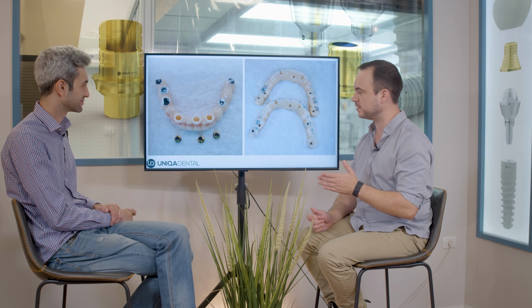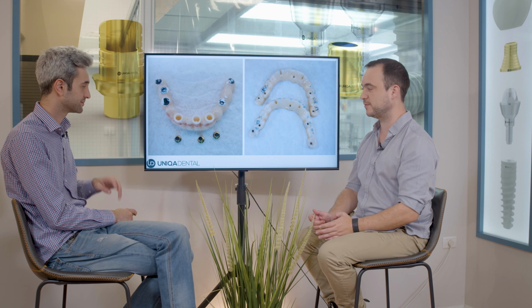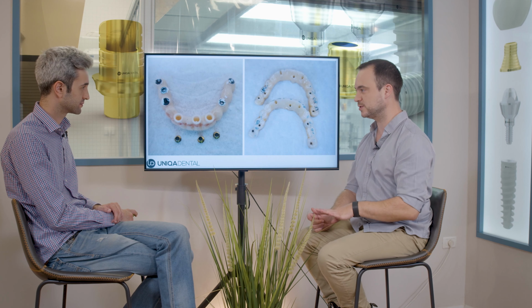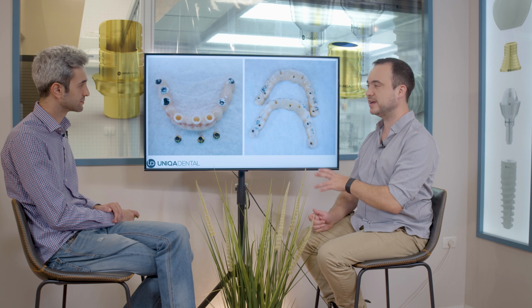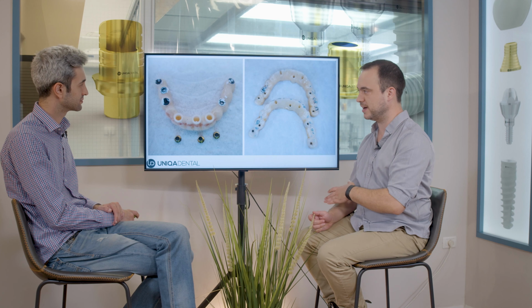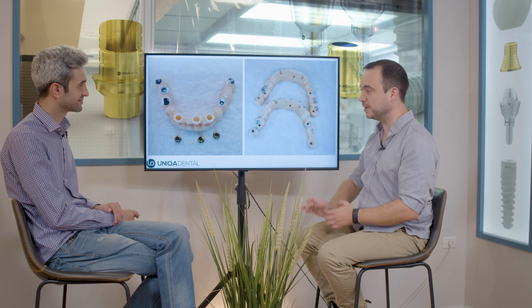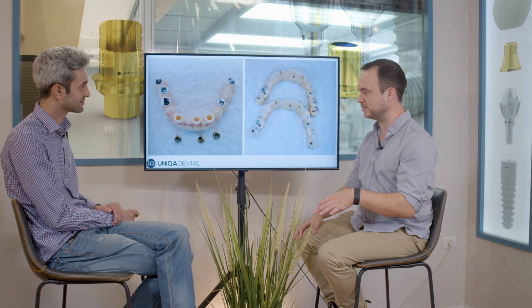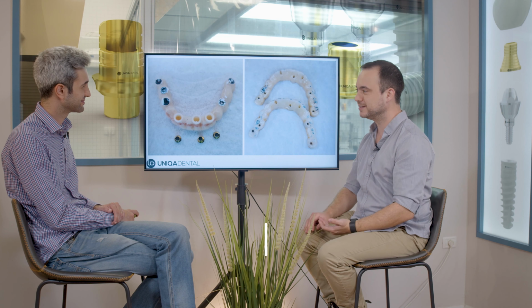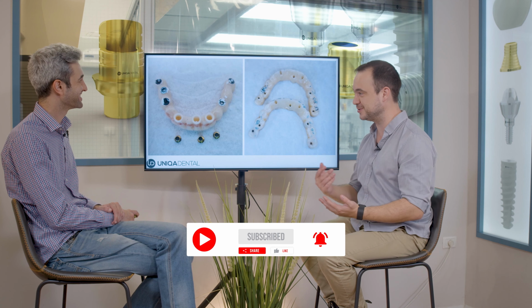So 5 sleeves, the posterior sleeves, we're holding inside the bridge using the toothpaste. And now in the first place, we'll cement only the first 3. The frontal 3. Yeah, the frontal 3. And then we screw all of the sleeves together. So we'll have a bridge inside the mouth with all of the sleeves, 3 cemented, 5 on toothpaste. You can see the contacts with these 3 sleeves and 5 on toothpaste. Later on, we'll take out the toothpasted sleeves and change the cementation process from toothpaste to real cement.